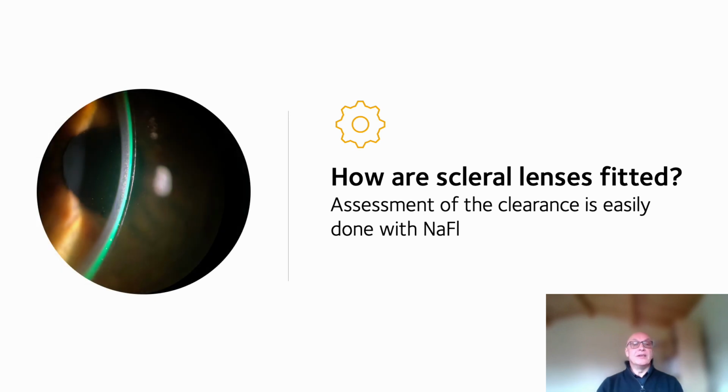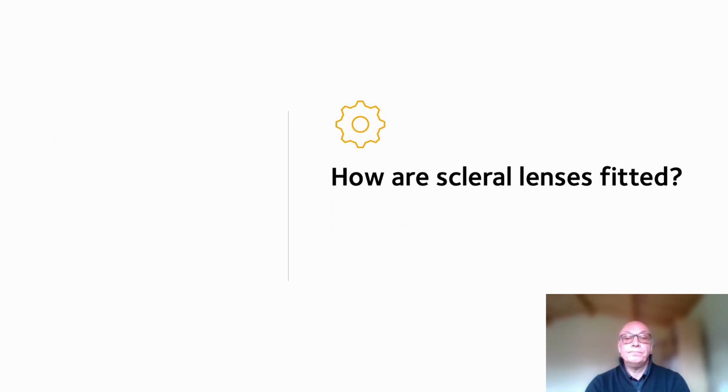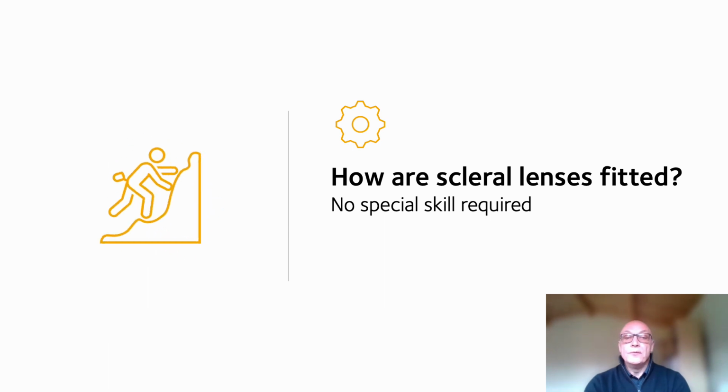And if we see this image here, we can see a scleral lens fitting on a patient's eye. You can see the cornea, the green fluorescein layer, and then the black layer of scleral lens on eye. All this is very easy to observe with our slit lamp, so there are no special skills required. All we need to be able to do is to observe that fluorescein layer with the slit lamp and have a look at the overall fitting of the lens, making sure that it's not digging too sharply into the conjunctiva.